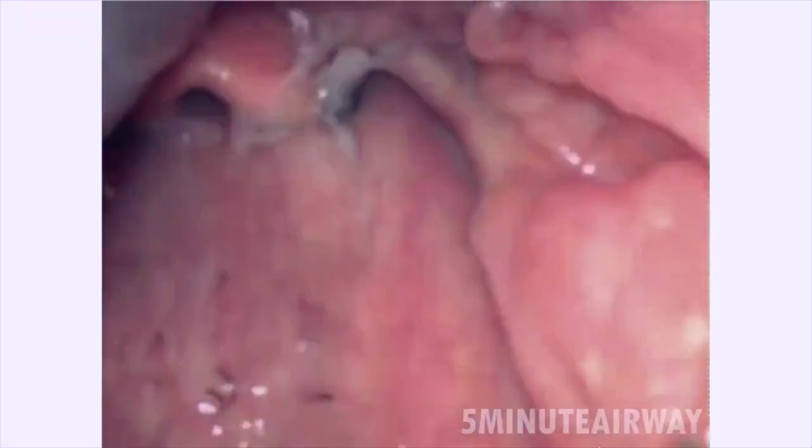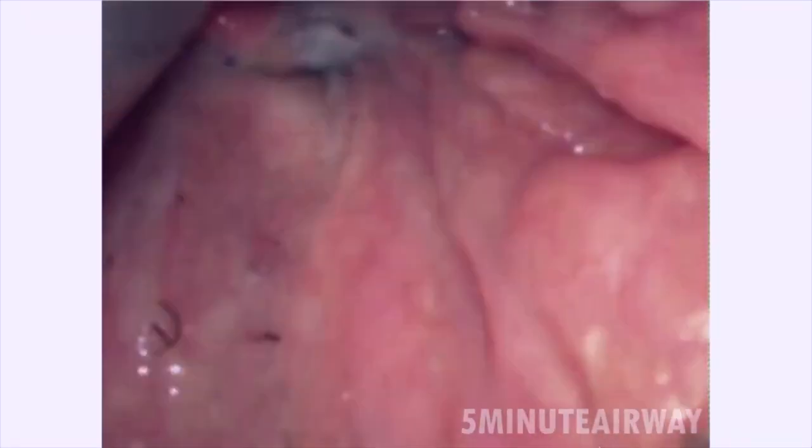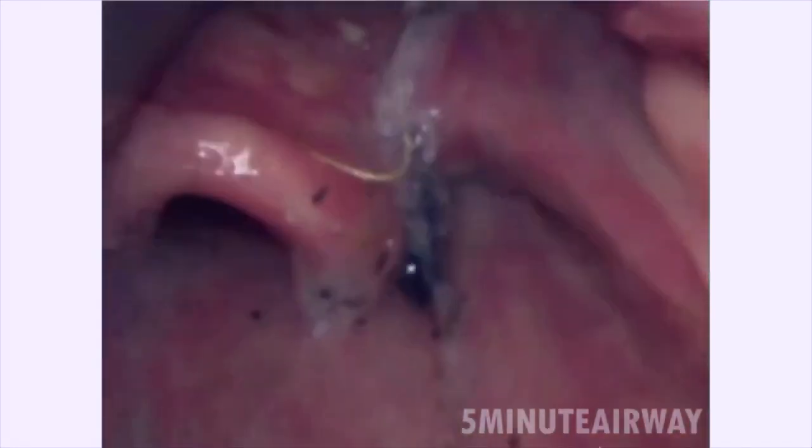Let's wind it back to the beginning real quick here. So we got a nice scissor grip into the mouth, right? It's a nice approach. We're getting hung up on the tongue there a little bit. And then this is where you're saying we're coming in a little lateral. Is that right? Okay, good.